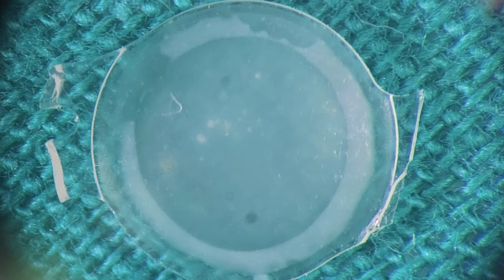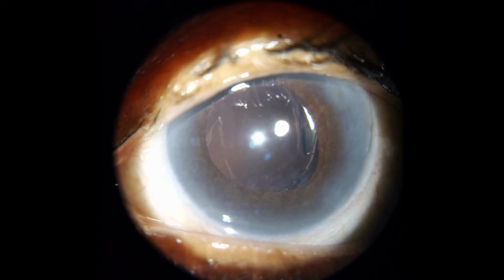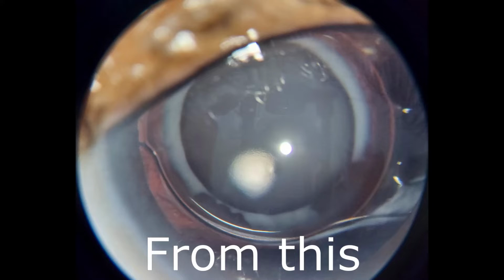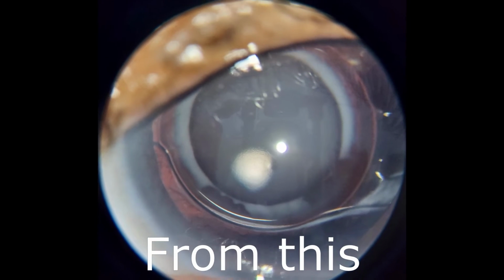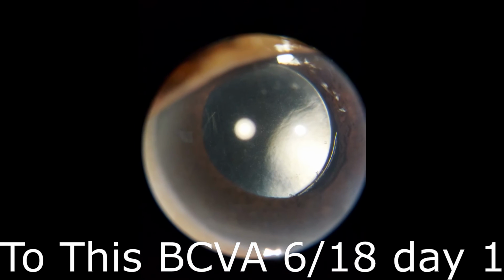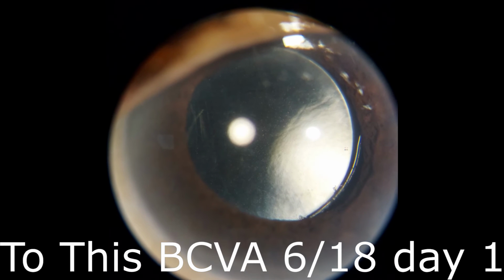This was the picture of the patient. The next post-op day, we can see a clear cornea, formed anterior chamber, and the IOL nicely in place. So this was the original picture, and we were able to restore this eye to its normal beauty, and the post-op vision the next day was 6/18.